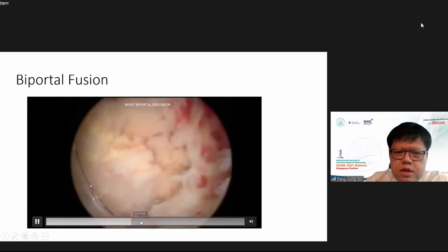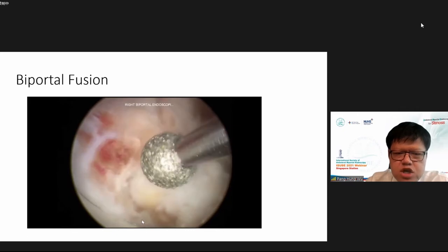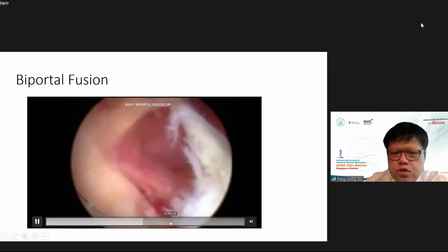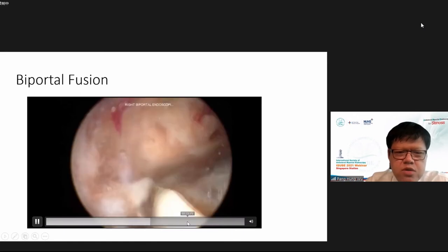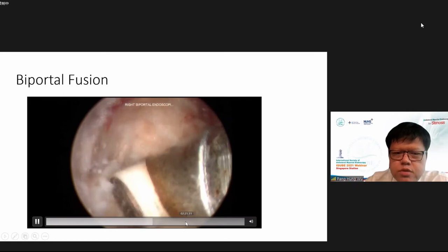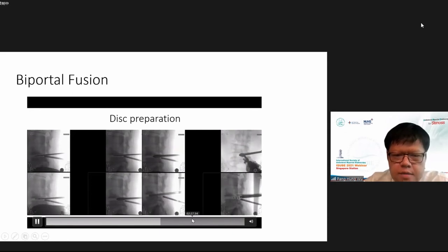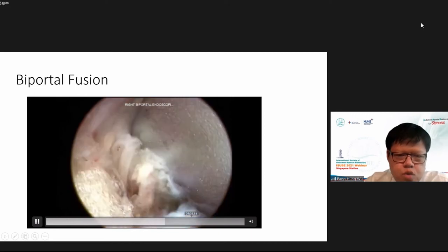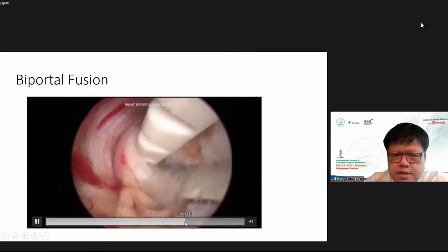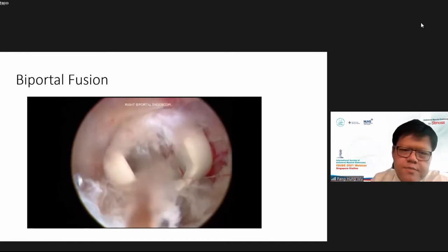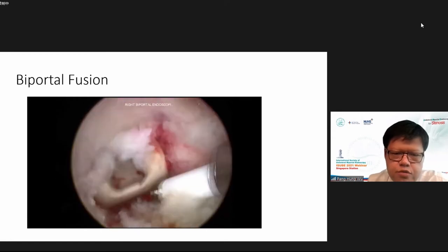Then the superior articular process is resected, exposing the ligamentum flavum attachment at the midline spinal laminar junction. I use the curette to lift the flavum as one piece. We use a radiofrequency 90-degree ablator for preparation. A special working retractor tube protects the nerve, and a retractor from various Korean companies is used to retract the nerve root.